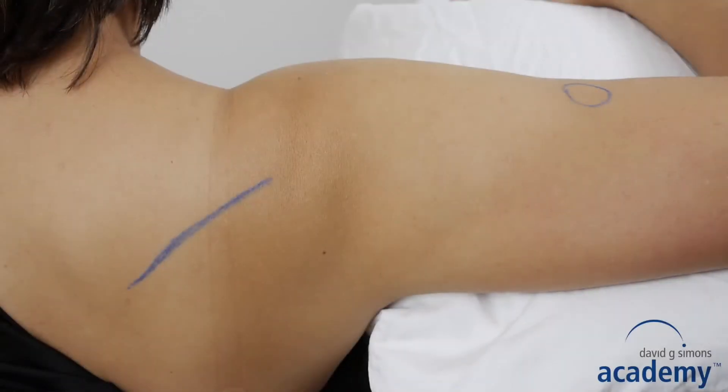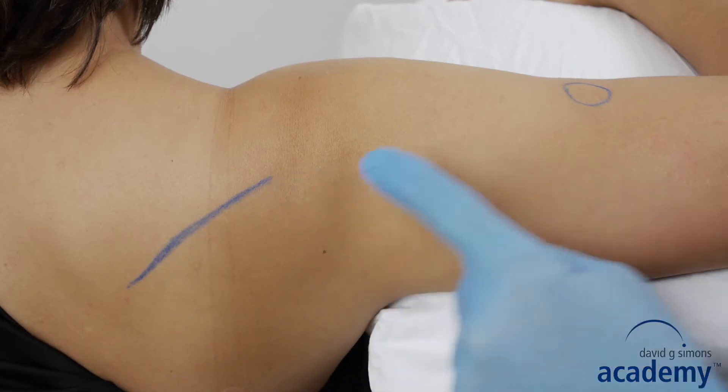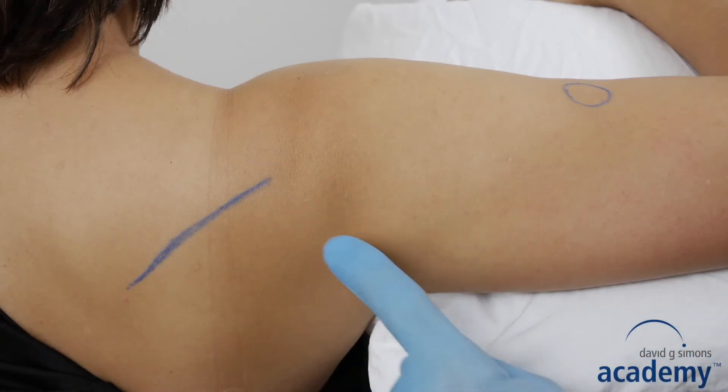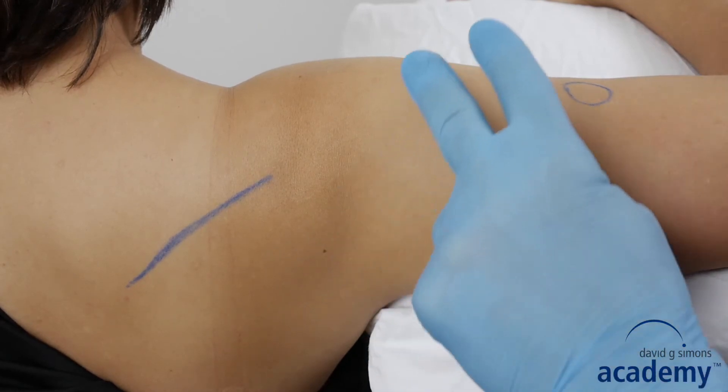These are the landmarks: the spine of the scapula and the deltoid tuberosity. Precautions are the shoulder joint, the radial nerve, and the axillary nerve.